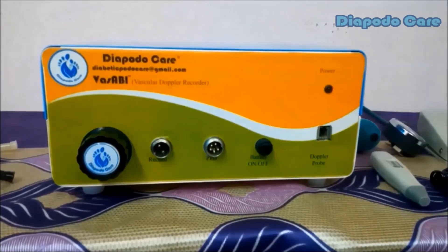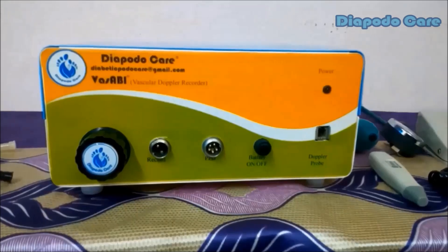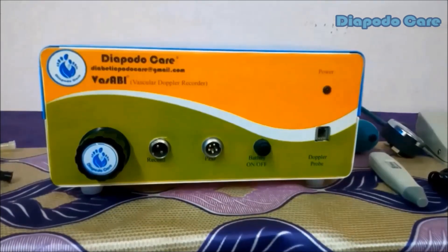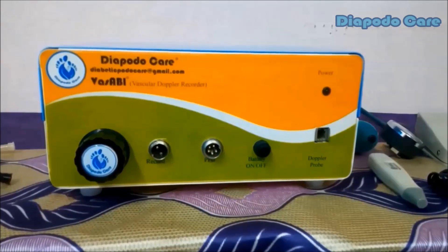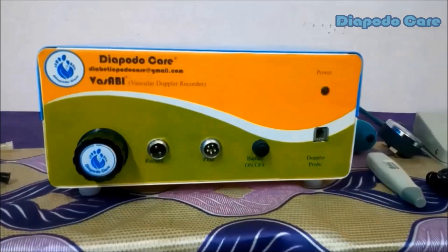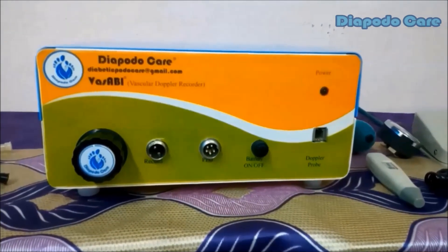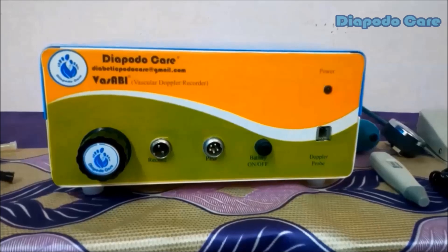Vassabi Vascular Doppler Recorder, manufactured by DiapodaCare. Our Vassabi works with exclusively developed PC-based interfacing software as well as an Android device application. We proudly announce we are the first company to introduce an Android-compatible vascular Doppler recorder in India.